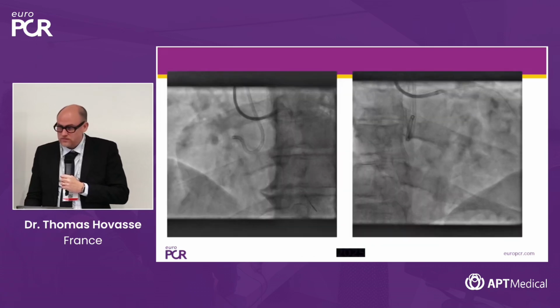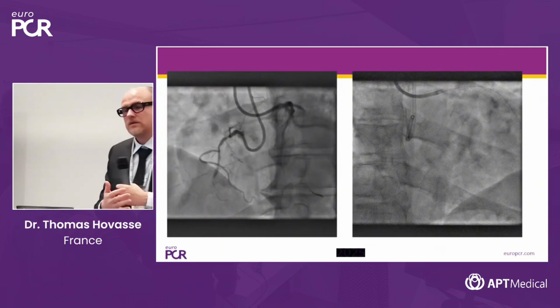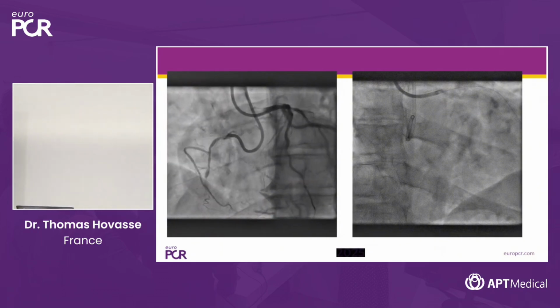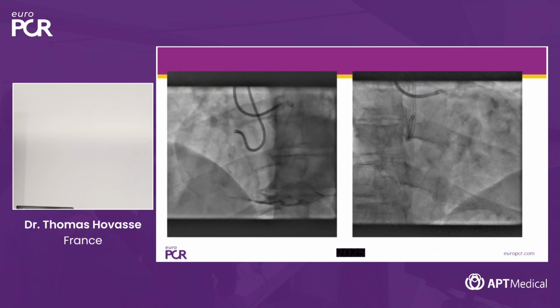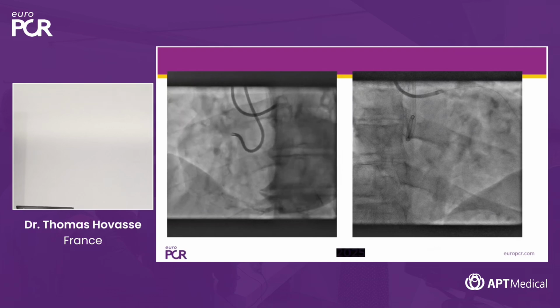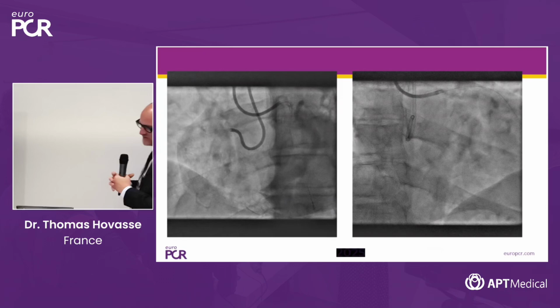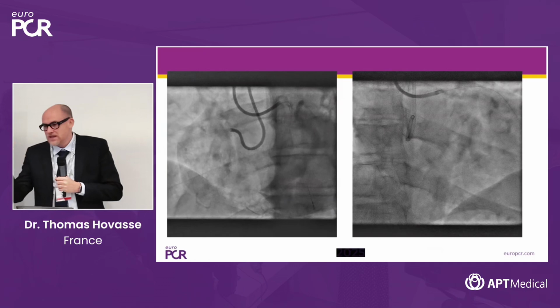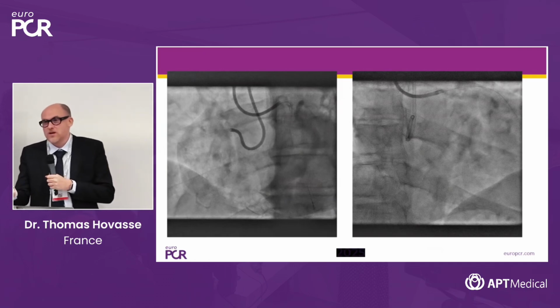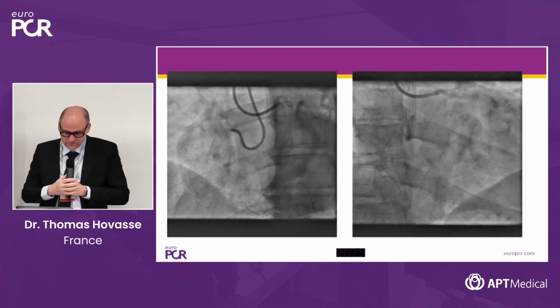So any question about this case? You did predilate before the extension to the right or not? Yes, to advance the Expressman, it was a predilatation of the first part of the CTO. It would be nice if it's going like this, but you have to predilate, and always the best way is to predilate and use the inflated balloon to gain support and advance the Expressman.